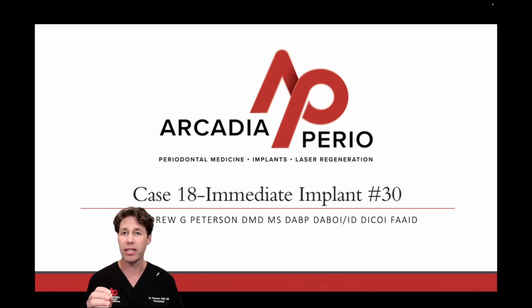I hope you're enjoying what you're learning so far and taking what you've learned and applying it to your day-to-day clinical practices. We haven't talked a lot about immediate implant placement. So today's case is going to highlight an immediate molar implant placement that I did at my office. I'm going to highlight the steps, the anatomical features in terms of what to look for, and help give you the confidence to do these cases predictably in your office.